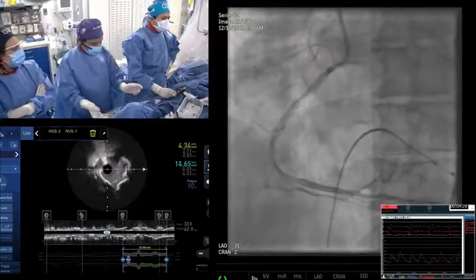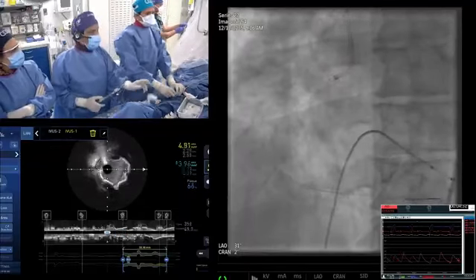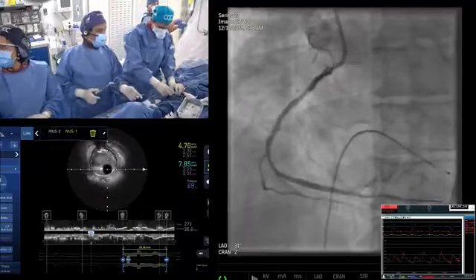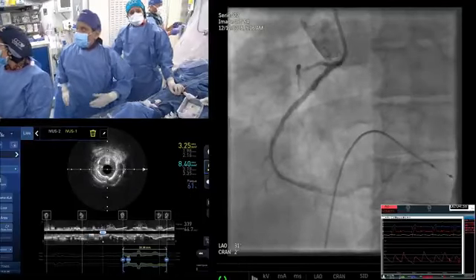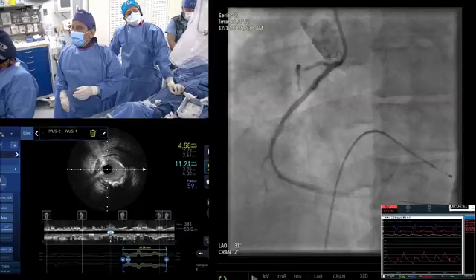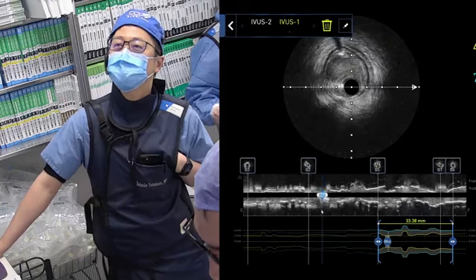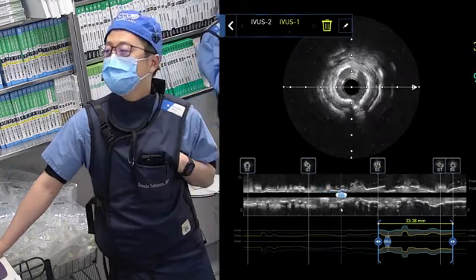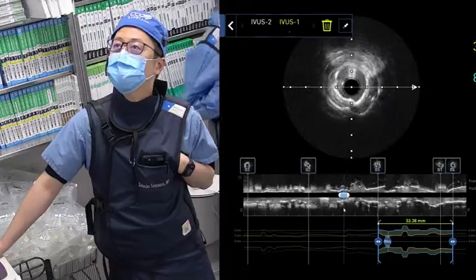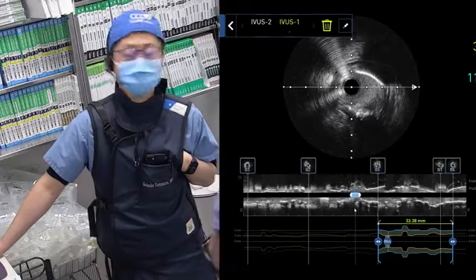Yeah. See, you want to go, otherwise that will look like 50%. If need be proximal, you do one more. I don't think you need it, but I know a lot of people do. Yeah, so this is the initial pullback. Like the area, this is a gap. Actually, the area is like 2 to 3. Actually, all diffuse plaque, even in the gap. In the gap, what is the area you're getting? 3.2? Yeah. 3.3? So proximal edge, come back all the way to the proximal.